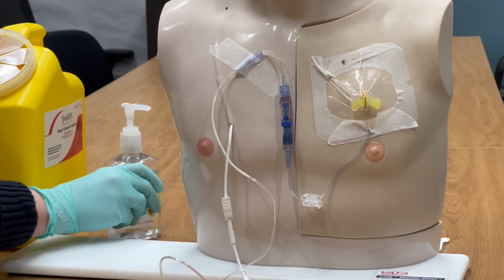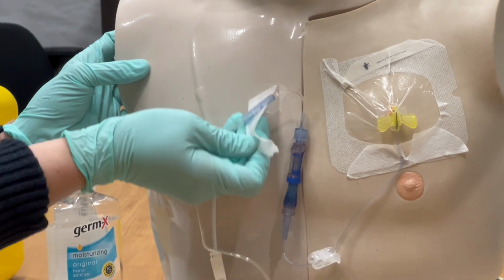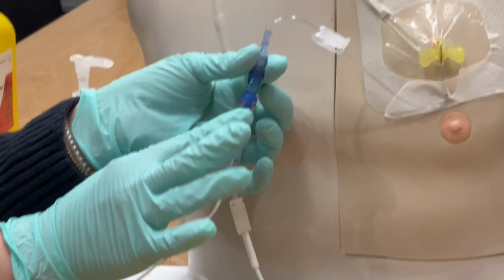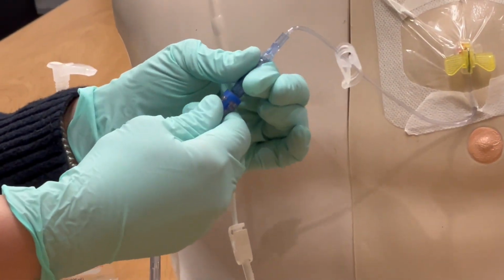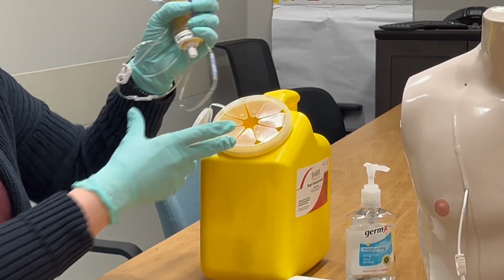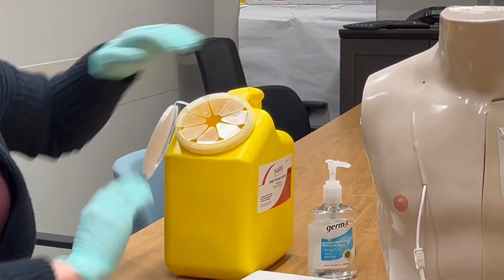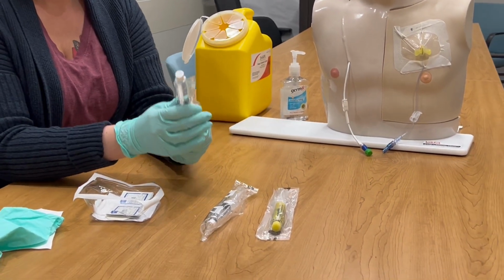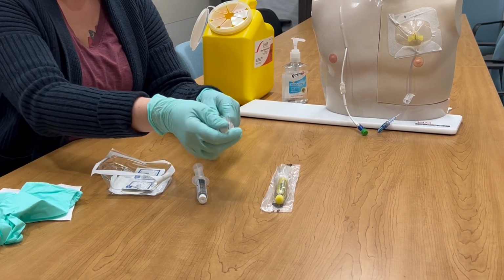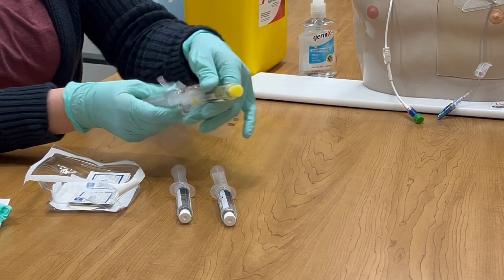Next, we're going to remove the flow restrictor that's been taped against the body. Now we can see the connection between the medication and the port needle tubing. So we're just going to twist to remove that. The empty chemo device goes into the chemo waste bucket. We can open up our wrappers so that we have everything ready.